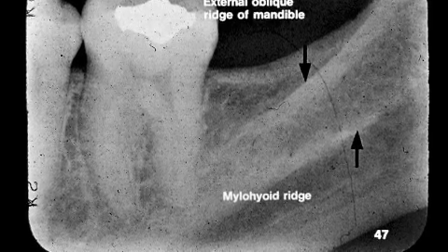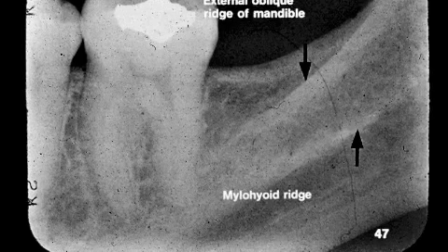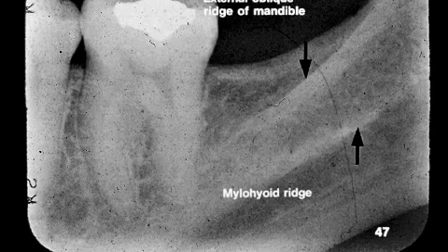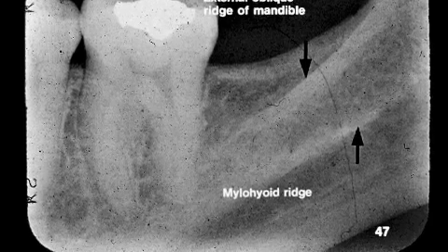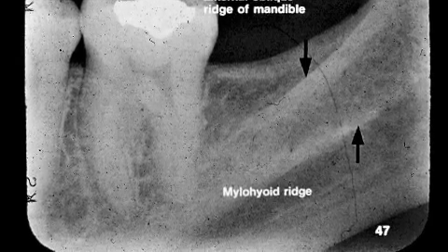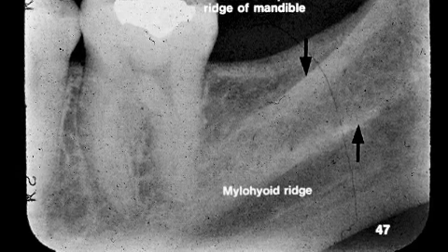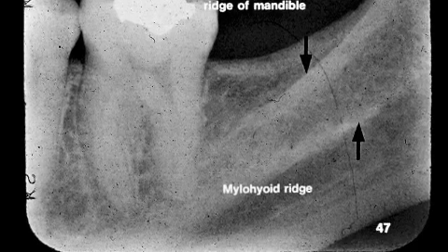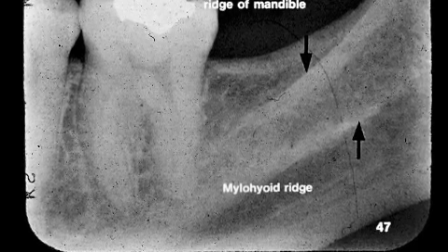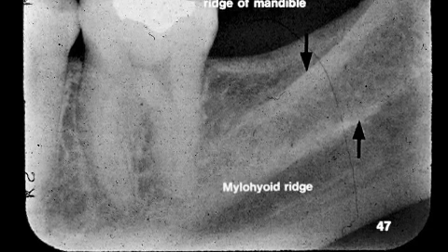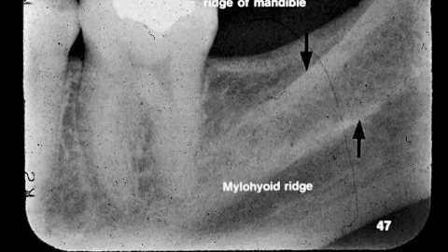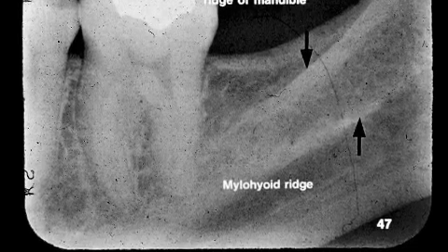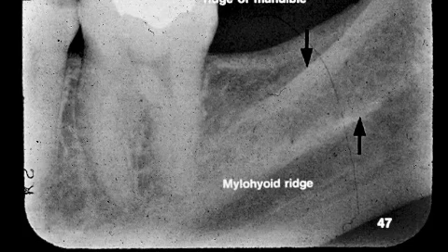Below the myelohyoid ridge is a large radiolucent area. This is the submandibular gland fossa, where the submandibular gland is located. It is a depression in the bone. The very lower edge of the mandible, or the lower border of the mandible, appears radiopaque and is also visible in this slide.